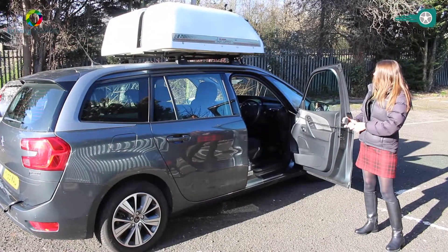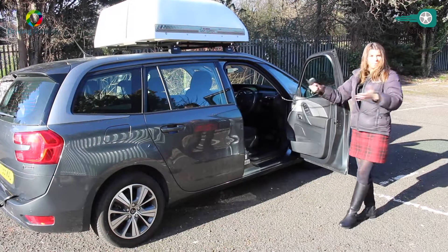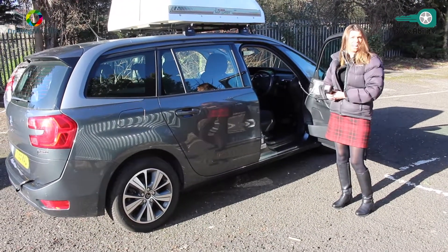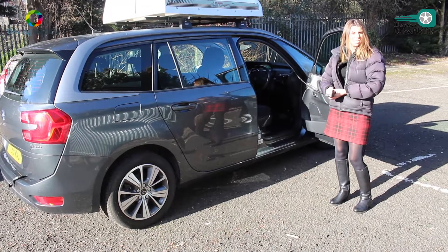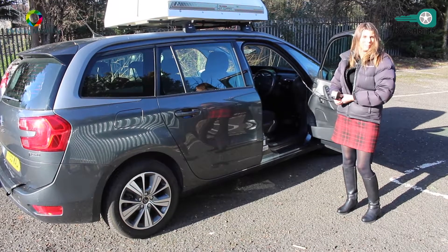Do you get lots of service users with this system? We do — it's very popular actually. Because it can all be done independently, the service user can stow their own wheelchair. They can transfer in and out of their wheelchair completely independently. So it's certainly a popular piece of equipment.